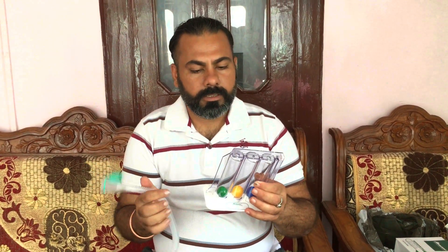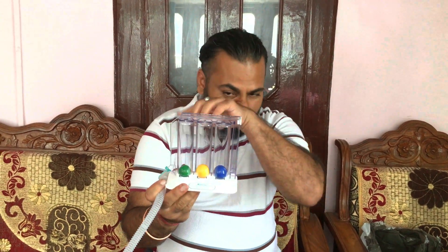So this comes with this pipe, and this pipe has a mouthpiece to breathe, and its quality is good and soft too. So what is this device? It is a simple device for lung exercise. You have to fit the pipe in it properly and keep the mouthpiece in your mouth and close it.